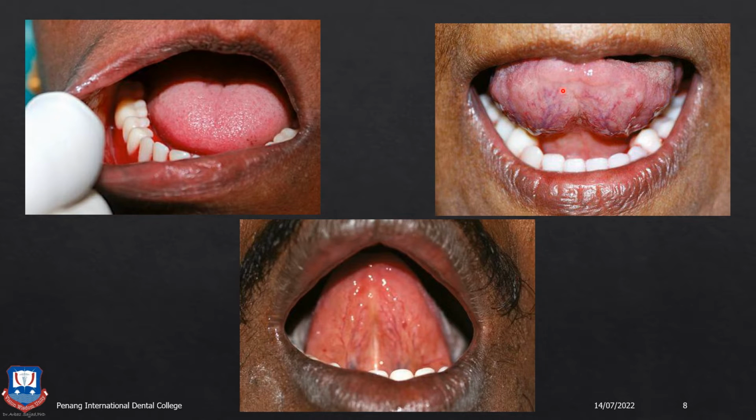Then you check for the space for the tongue. Here you can see the teeth are arranged in such a way that the tongue is large and there is not enough room for the tongue to lie within the mandibular teeth arrangement. This will create instability. Then you also have to check the alveolingual sulcus, whether the denture extensions are such that they do not cause dislodgement or displacement of the denture.